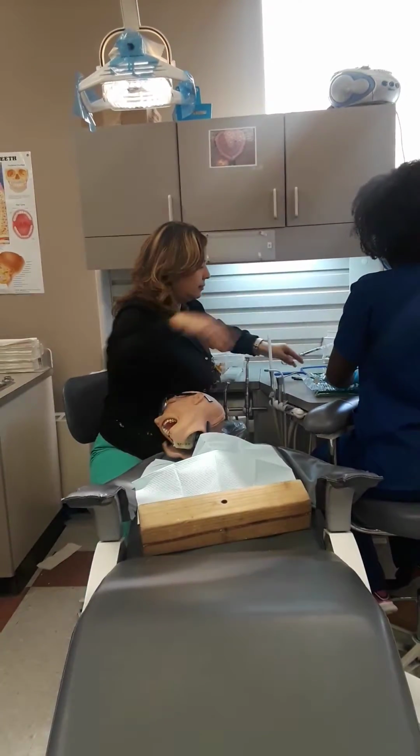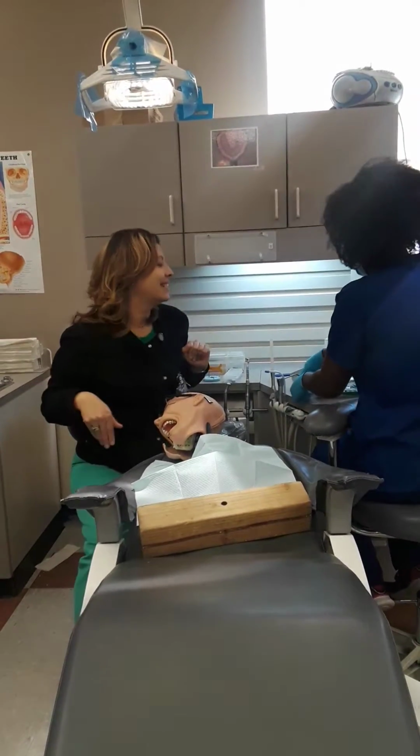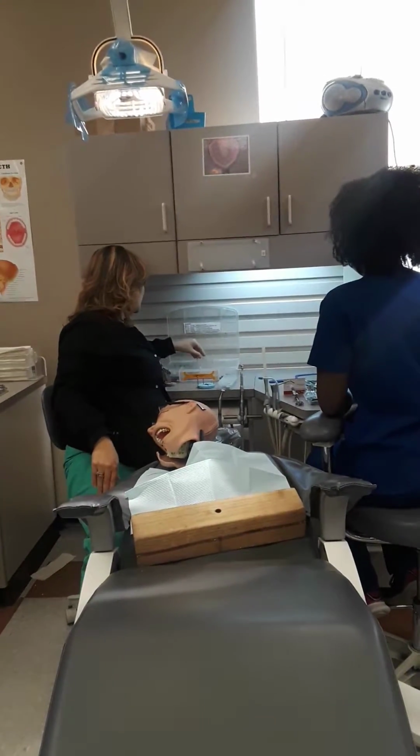Okay. Where are we at now? Sorry. Plastic matrix. So we need our plastic matrix, it is for anterior.